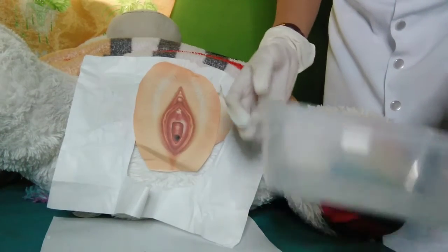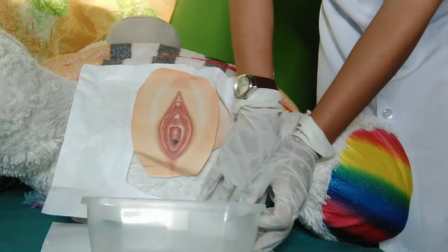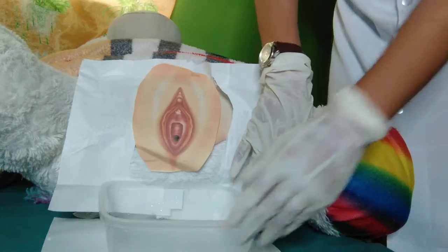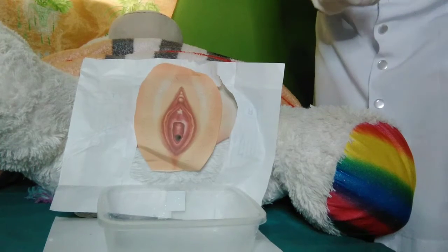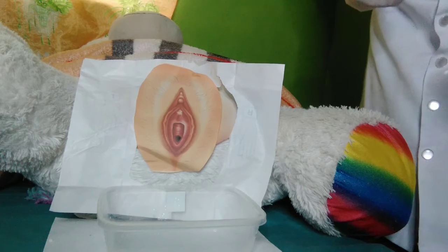So place a sterile tray with the catheter between the patient's legs. The sterile tray will collect the urine once the catheter tip is inserted into the bladder. So let us clean the perineal area.